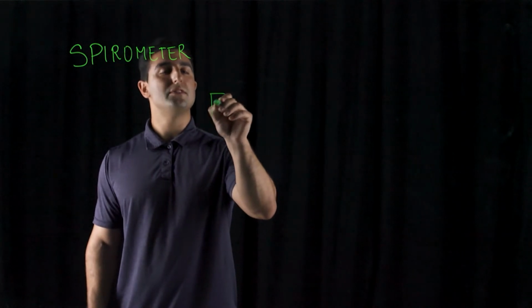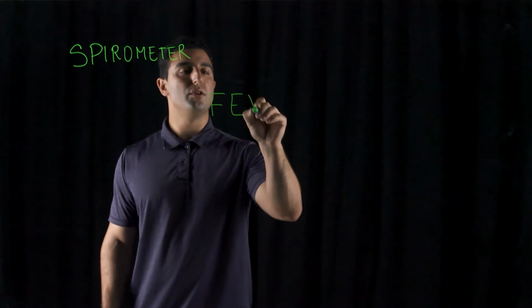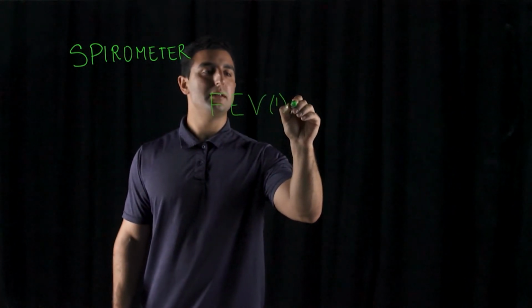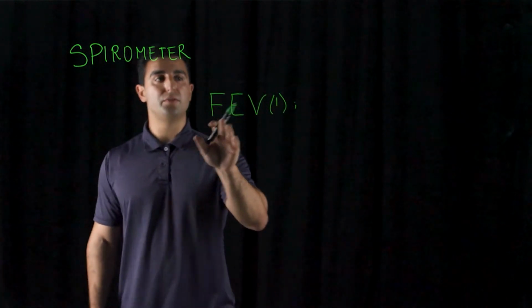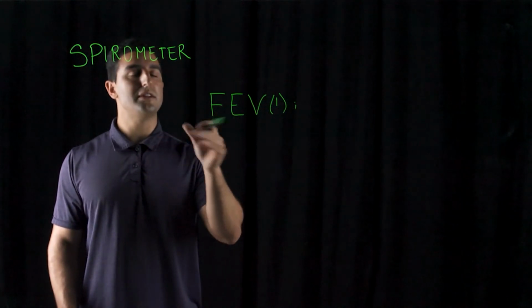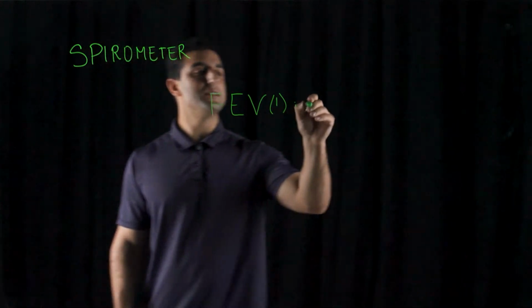And so the way they're measured is through ratios based off of a comparison. You have forced expiratory volume 1, so you see this one length here. This is the total amount of gas being released out of your lungs in 1 second.